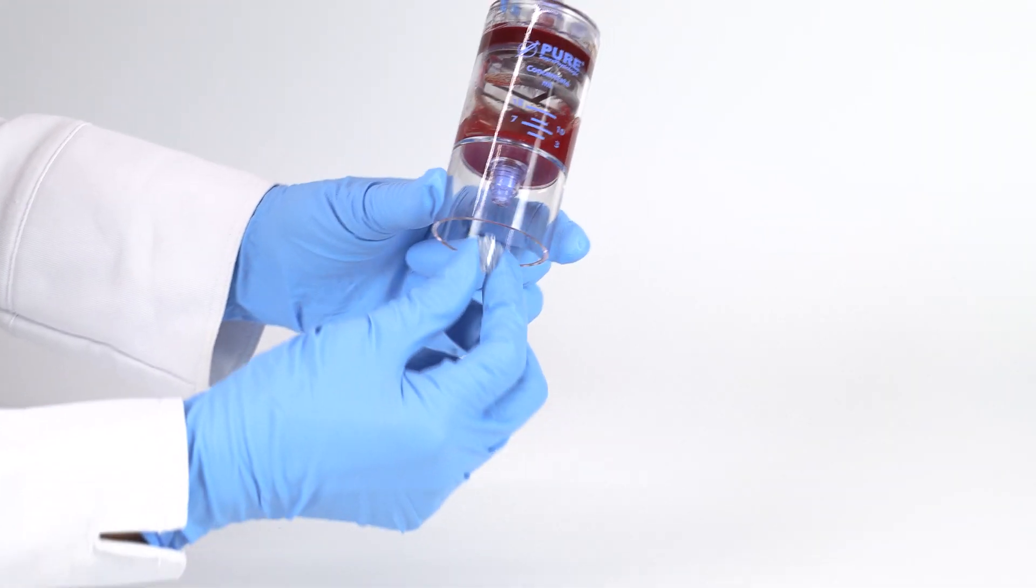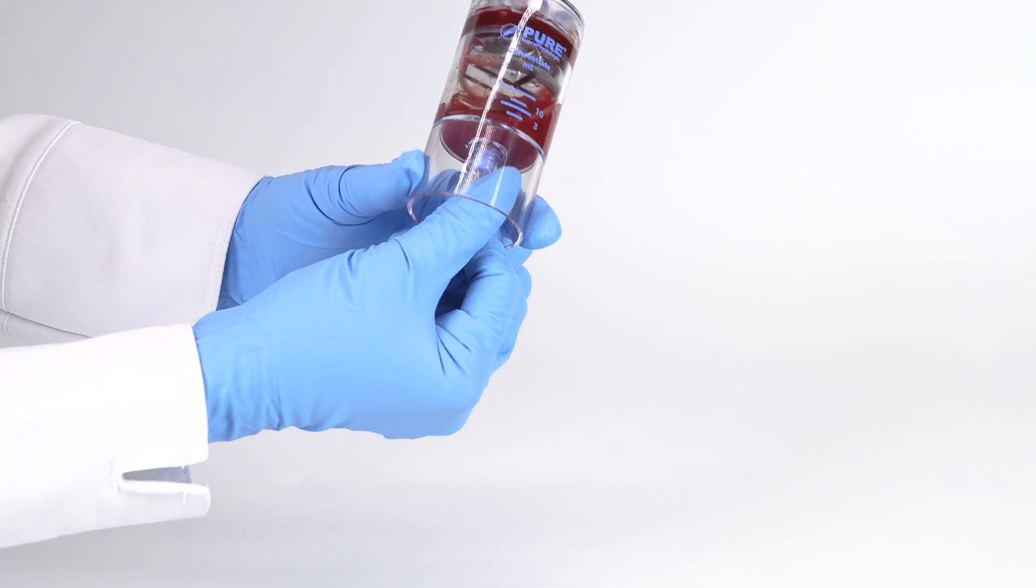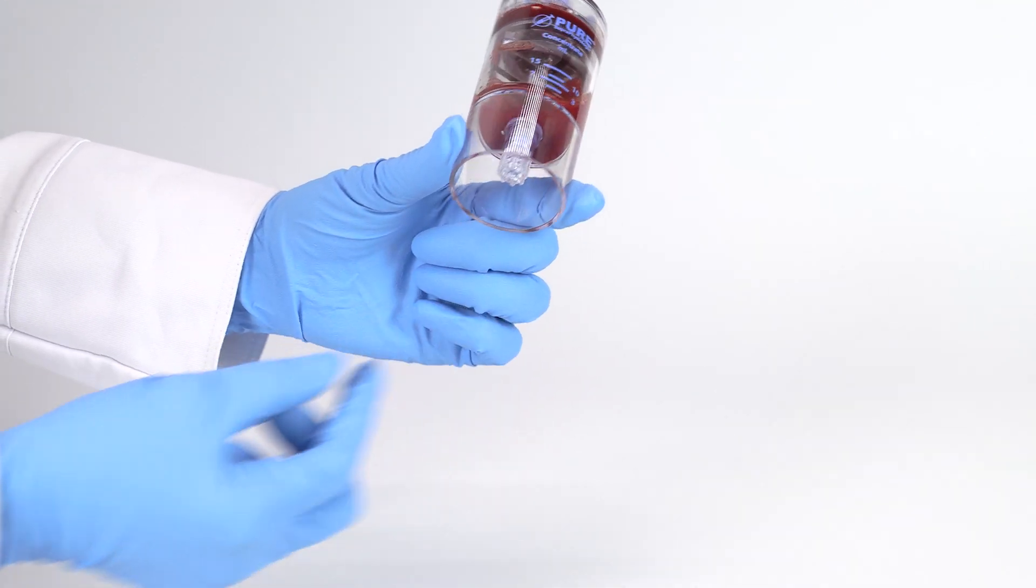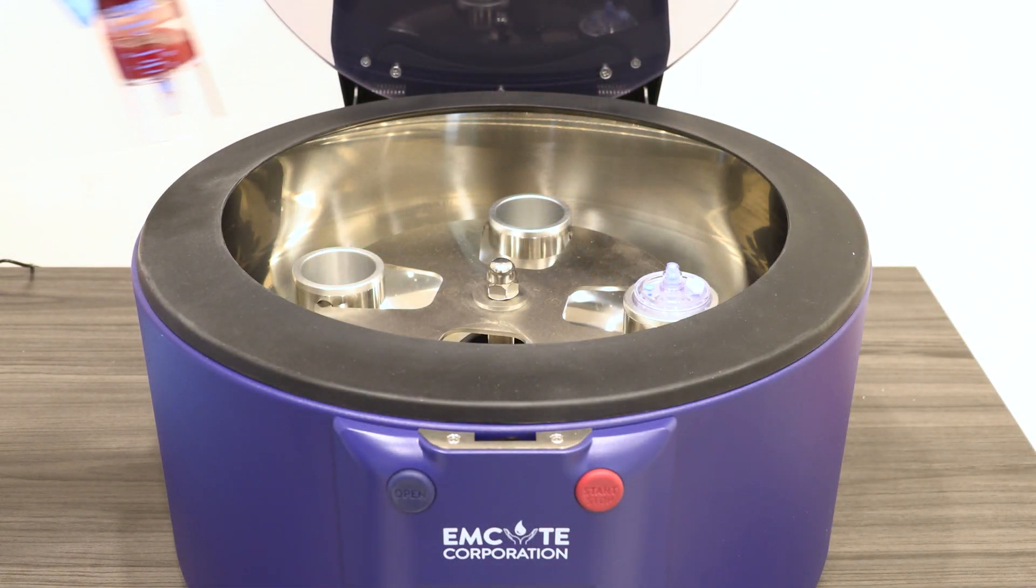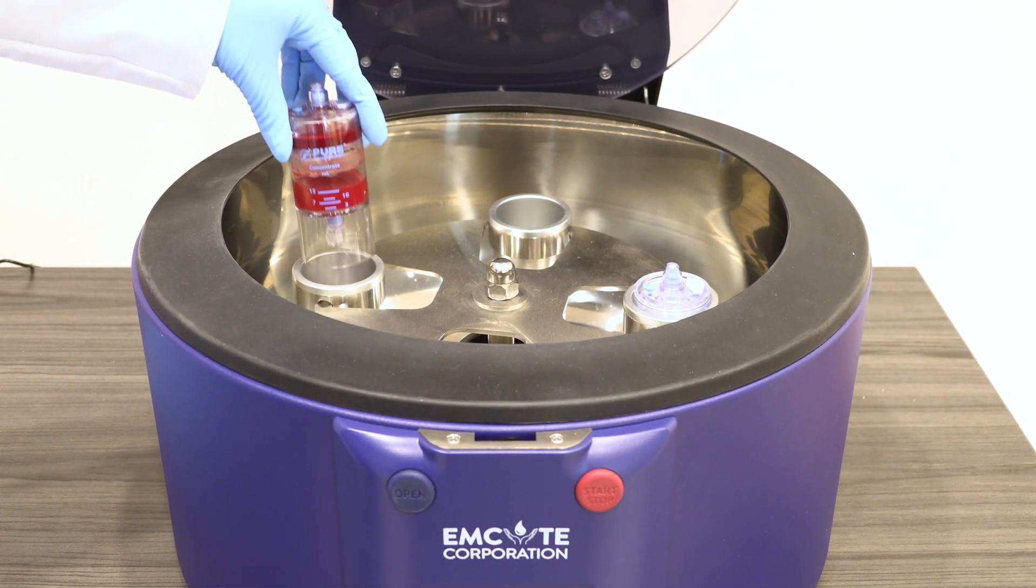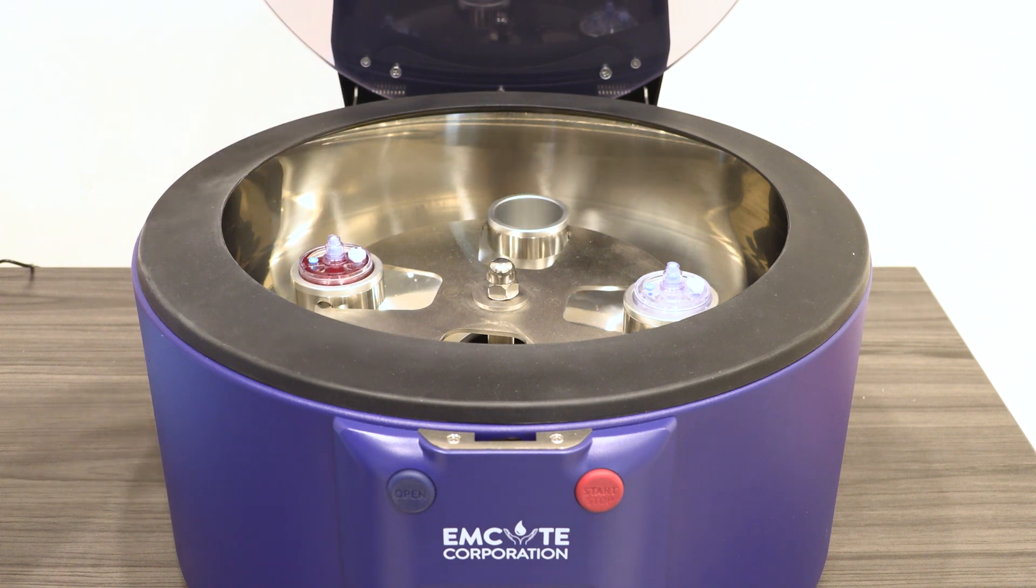Place a sterile clear non-vented cap back onto the bottom port and place back into the centrifuge rotor at opposite ends. Follow the protocol settings provided in the Pure BMC2 IFU insert. Close the centrifuge lid and press start.